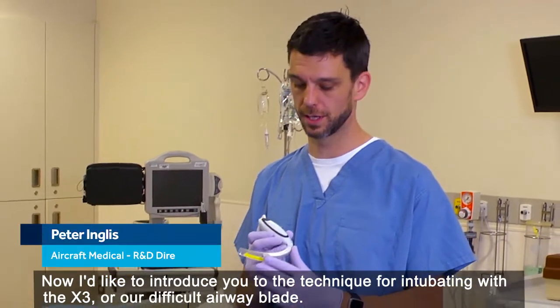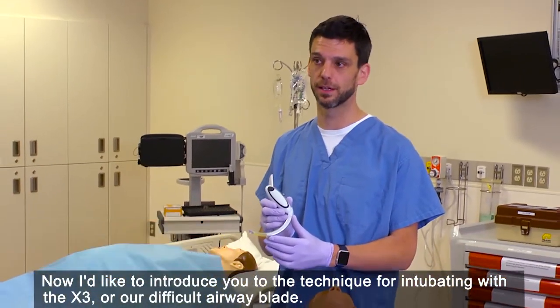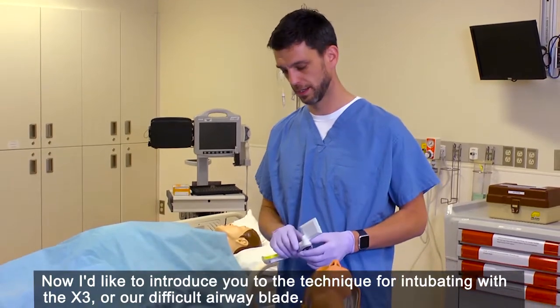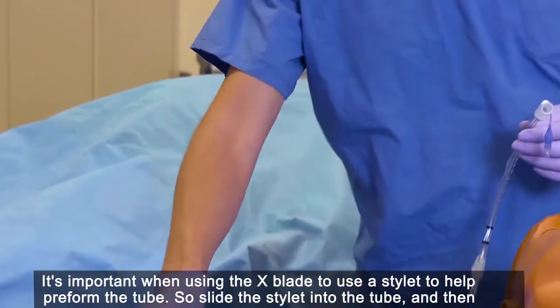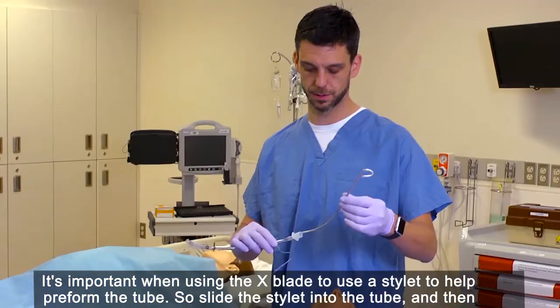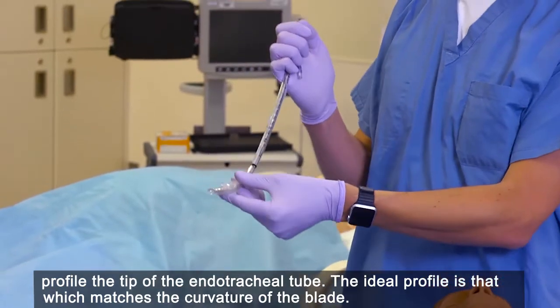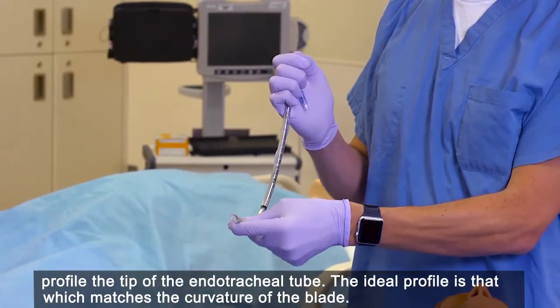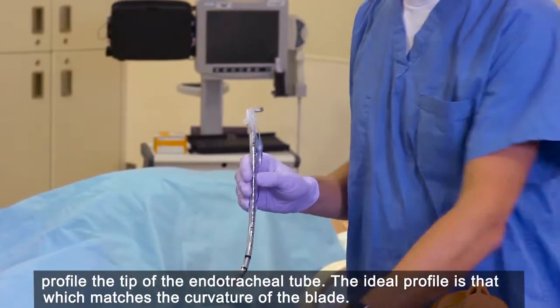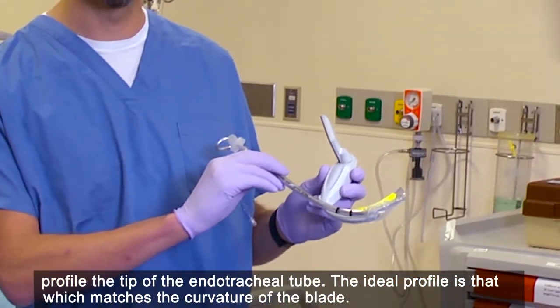I'd like to introduce you to the technique for intubating with the X3, our difficult airway blade. It's important when using the X blade to use a stylet to help preform the tube. Slide the stylet into the tube and then profile the tip of the endotracheal tube. The ideal profile is that which matches the curvature of the blade.